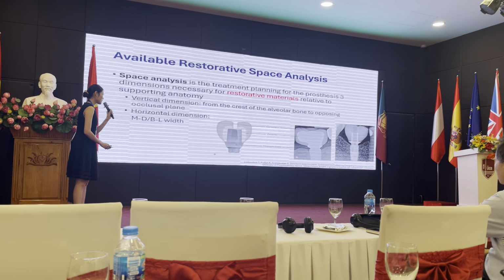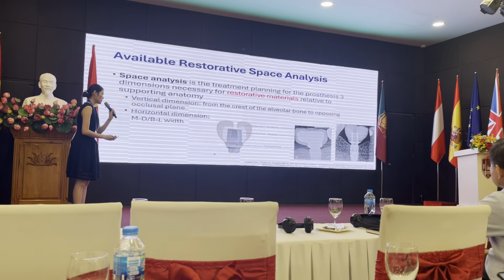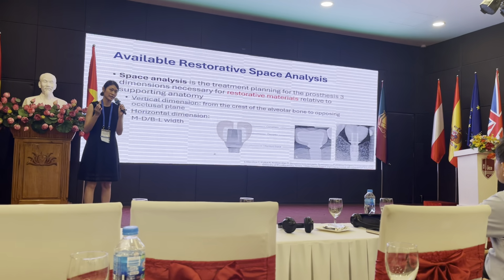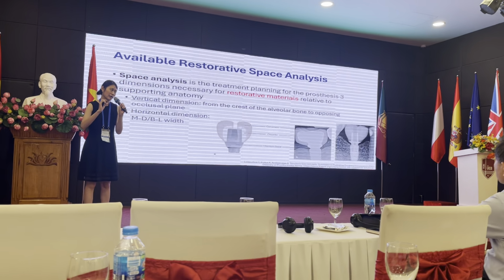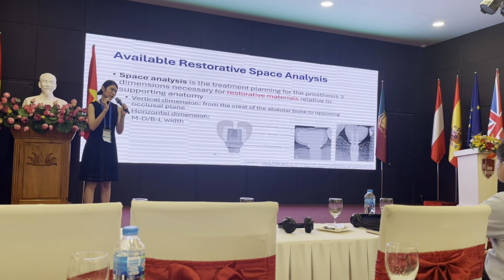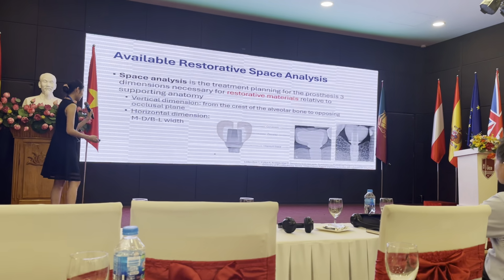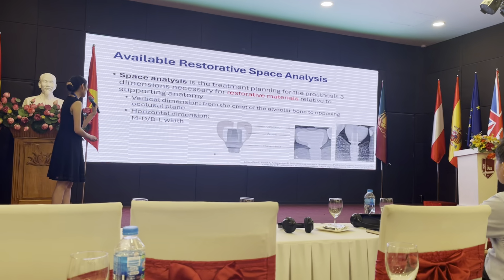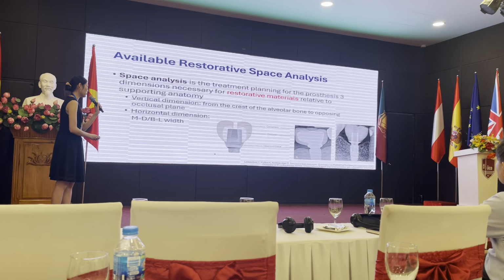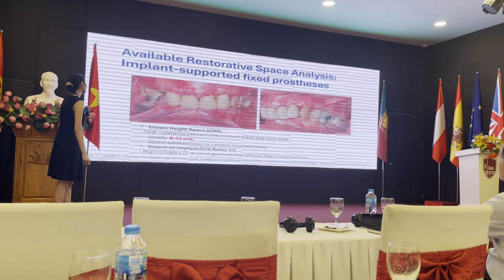So I think this is really related to what material you have. Because when you place a dental implant, you want to consider first the biological width, second the abutment height, and then above the abutment you have the occlusal material, composite, and also the Teflon, and that all takes up space. And for the horizontal dimension you will estimate the mesiodistal and buccolingual width of the tooth.